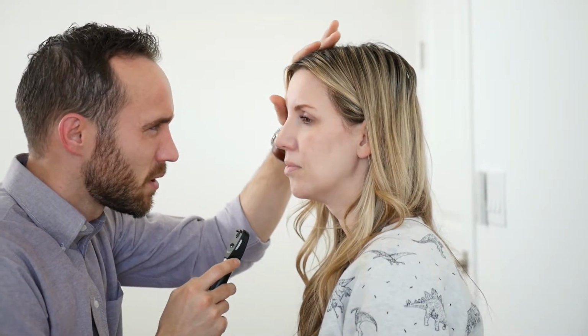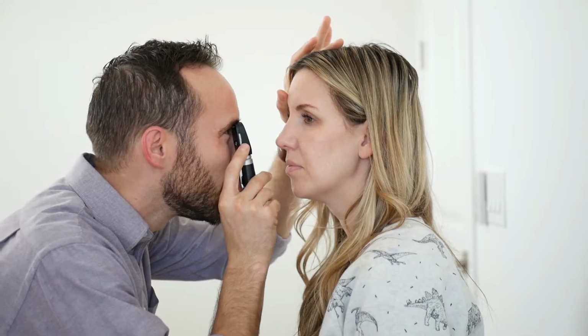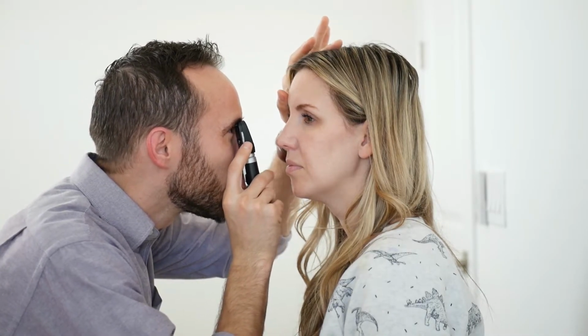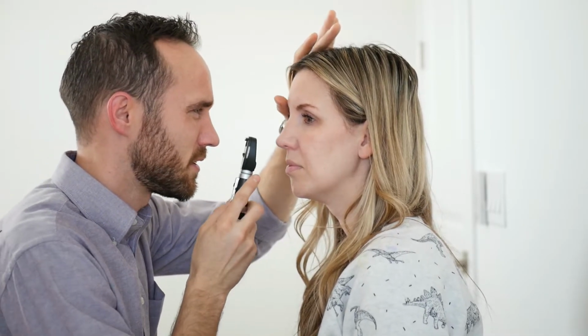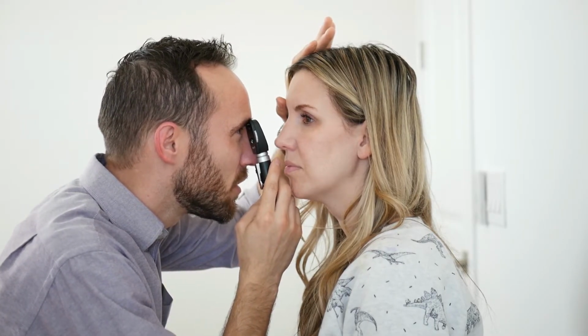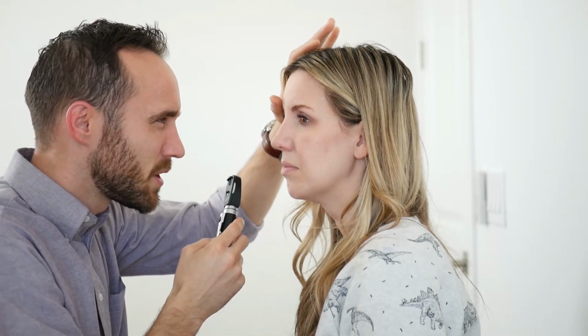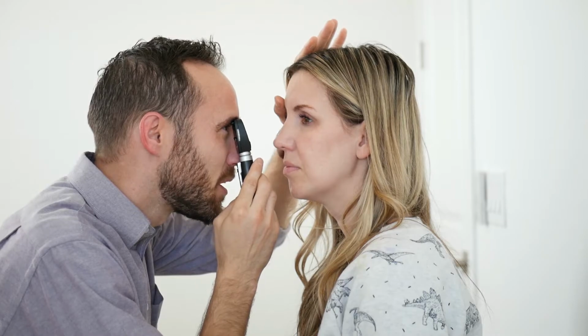Okay? Going back to the appropriate diopter, I'm going to 6 now. Again, with the opposite hand and with the right eye here, I'm looking into the eye, looking at posterior portions. You want to get nice and close. Now I'm observing for the optic disc, which is yellow in color, yellow to pinkish, and is clear on the margins.